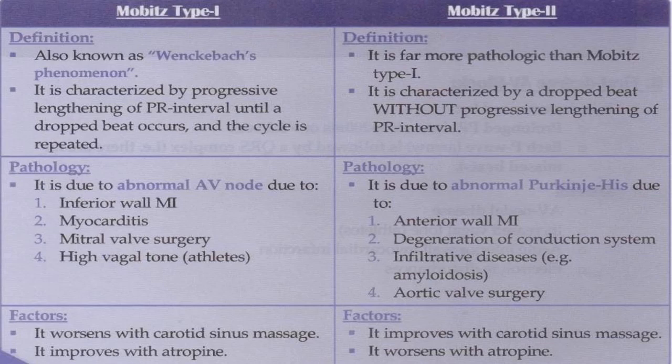Mobitz type 1 is worsened with carotid sinus massage and it improves with atropine. However, Mobitz type 2 is improved with carotid sinus massage and it worsens with atropine.